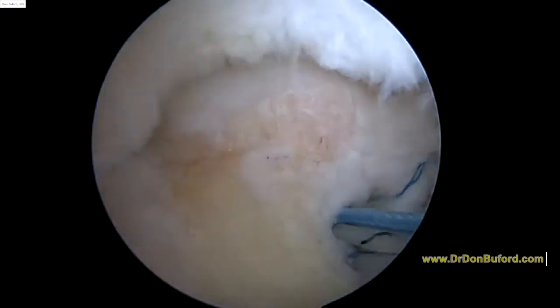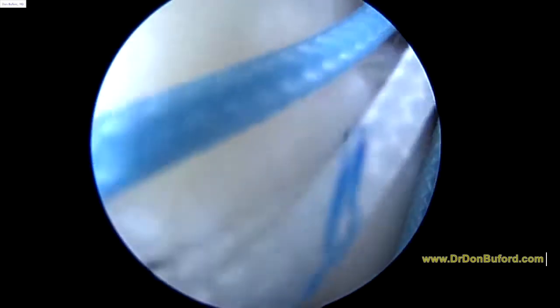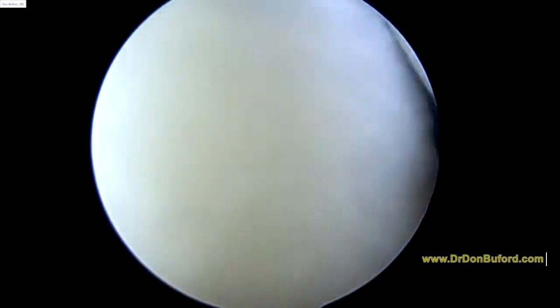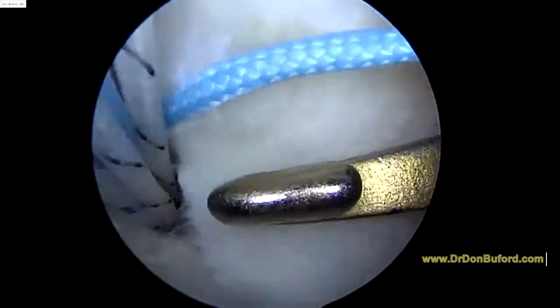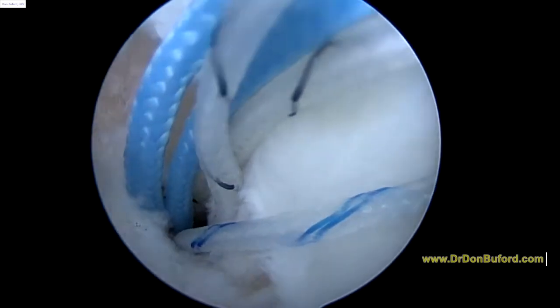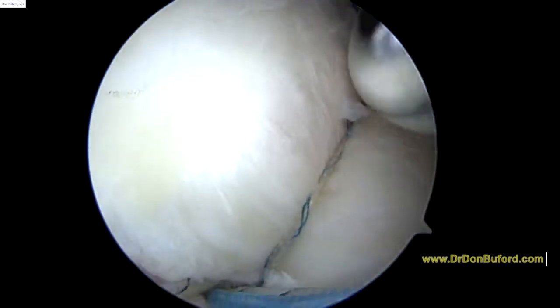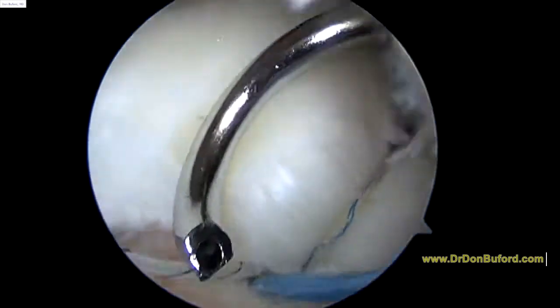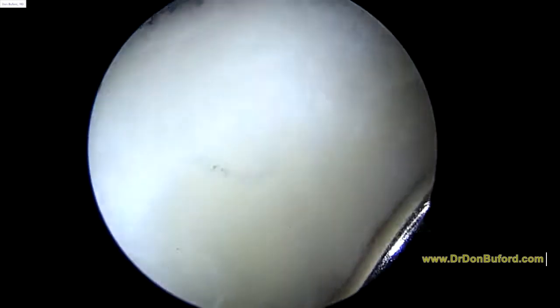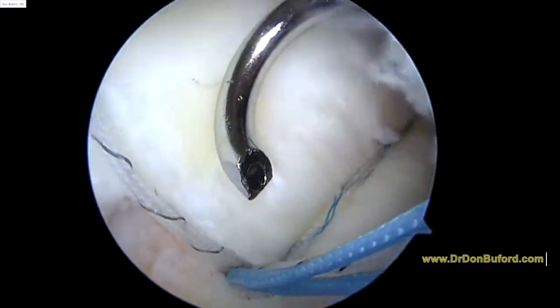We'll reach in with the partner stitch, to retrieve the partner stitch, I should say. And we know we want this blue and white stripe from the way over here. Yeah, that's a good shot there. And here you can see the first stitch that we've tied. We're going to pass another stitch right about here.